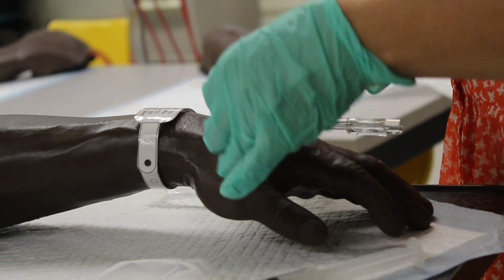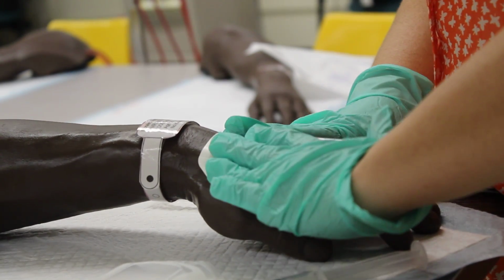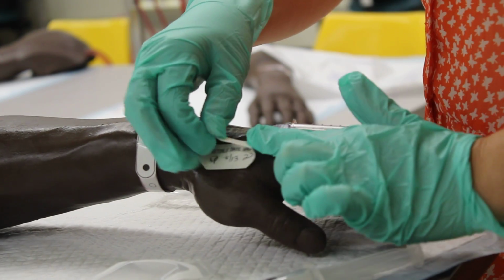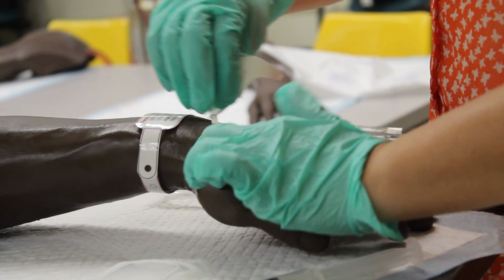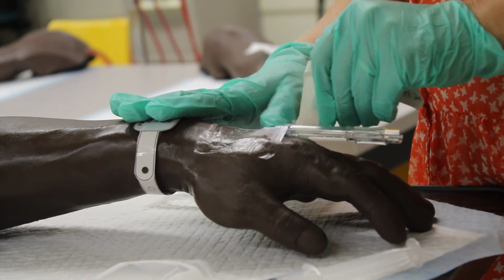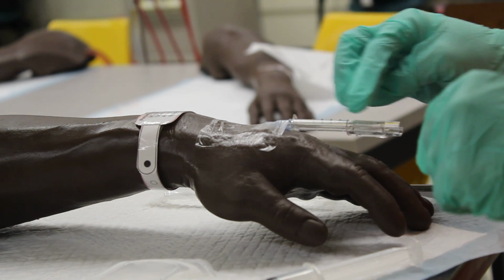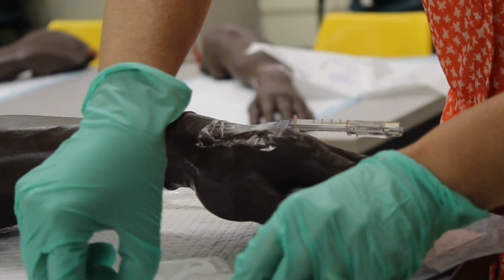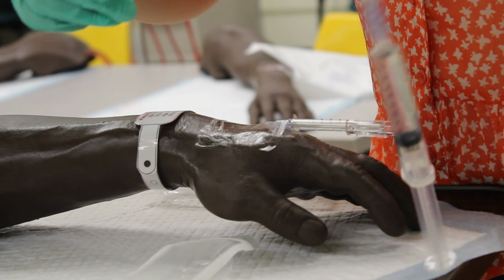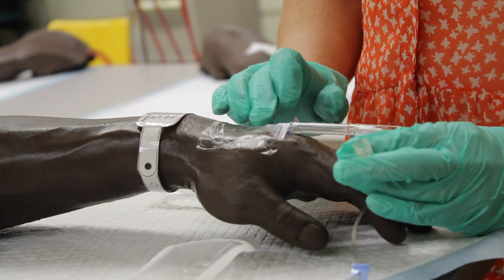Then you can actually stabilize it with your Tegaderm. And we know that's stabilized on there. The whole time you can talk to your patient, make sure your patient knows what's going on and that they're tolerating everything okay. There. Now I want to get ready to disconnect my needle from my hub and connect my extension. So I want to loosen the cap of the extension, have that ready. I want to never take my eyes off that, make sure I do not touch or contaminate it.